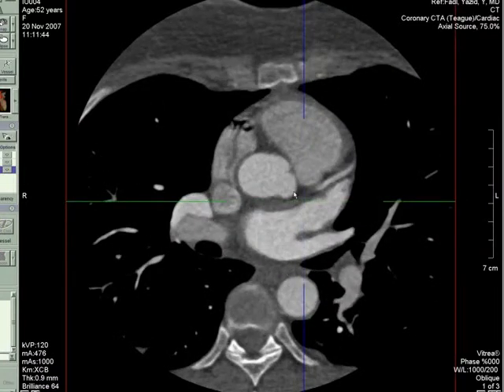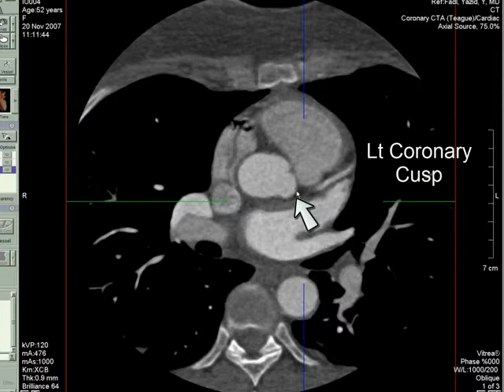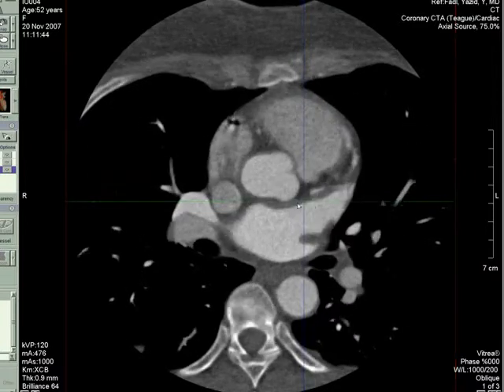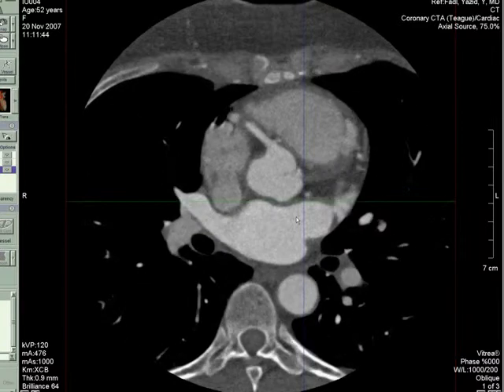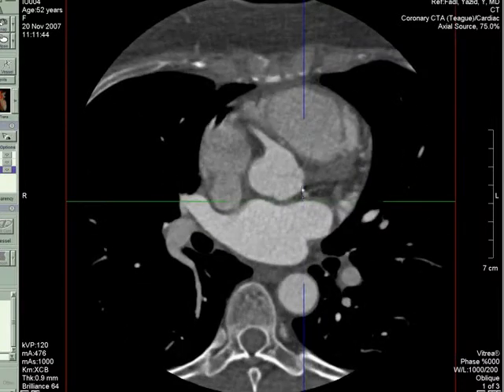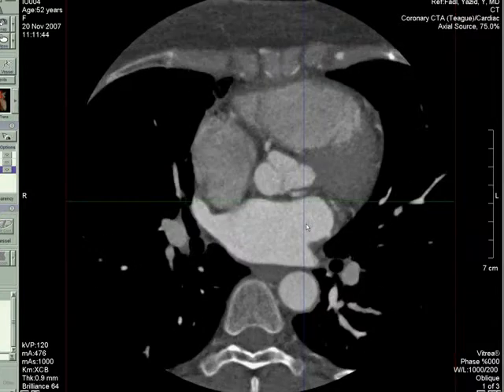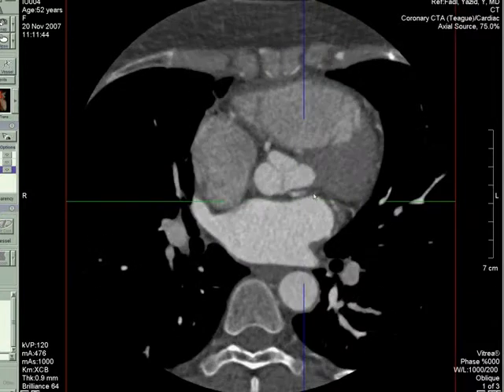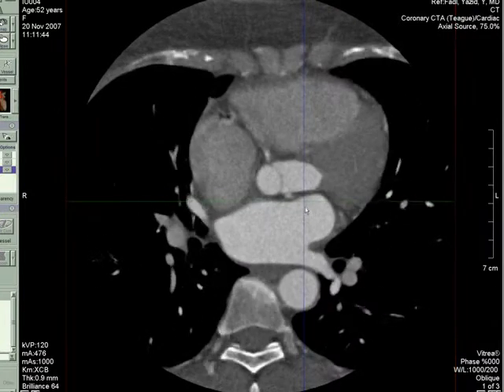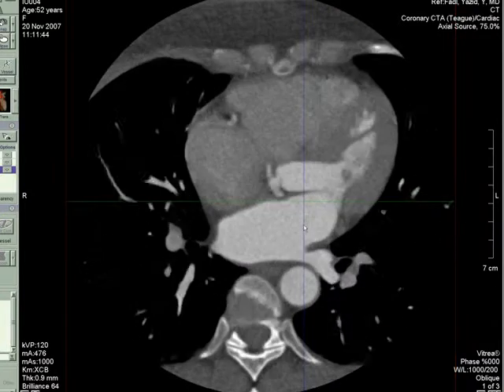here's the left coronary cusp, and that's where the left coronary artery is supposed to come off of. However, you don't see anything quite yet, and you can actually see that there's a vessel that doesn't quite connect to it.